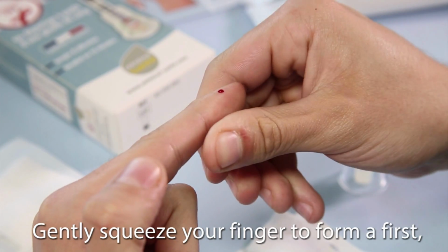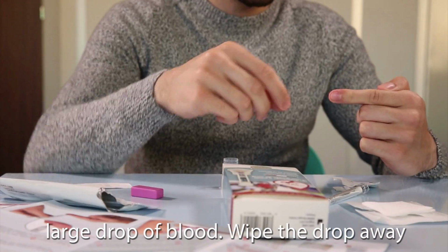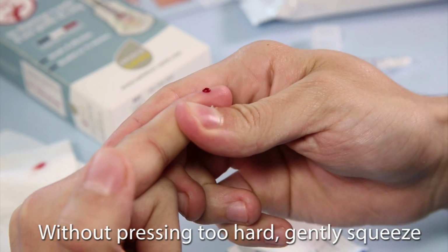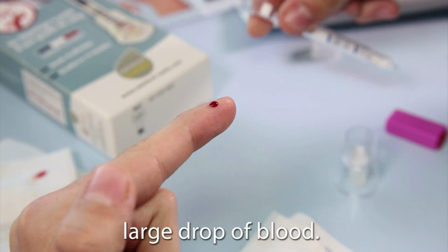Gently squeeze your finger to form a first large drop of blood. Wipe the drop away using the sterile pad. Without pressing too hard, gently squeeze your finger once again to form a new large drop of blood.